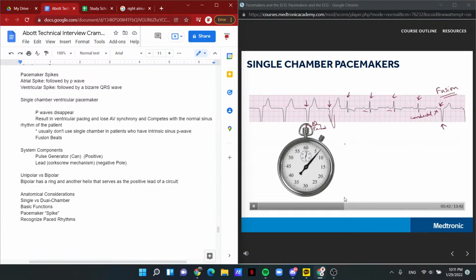Essentially, pacemakers are built like a clock. And think of this clock as set for a certain period of time. For example, if the pacemaker is programmed for 60 beats per minute, that means every beat takes 1 second, and therefore the clock runs for exactly 1 second, or 1,000 milliseconds. With every paced beat, that clock starts, and if the clock runs out, then the pacemaker sends out another pacemaker spike, resulting in the next heartbeat.